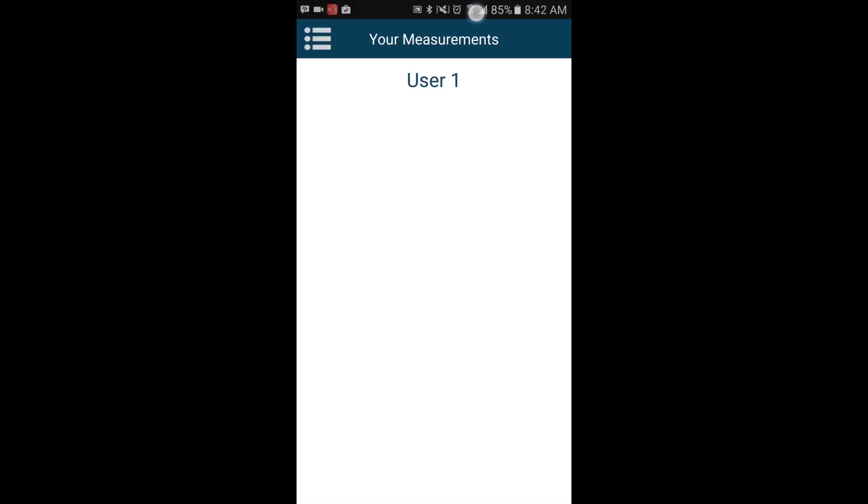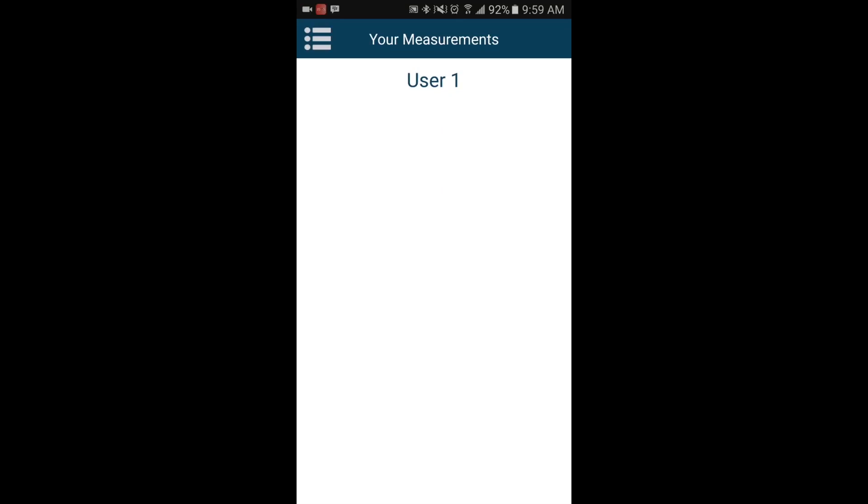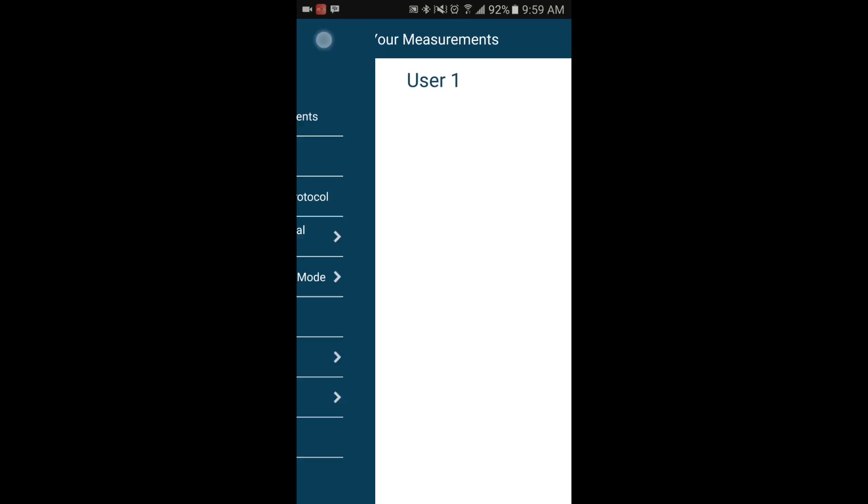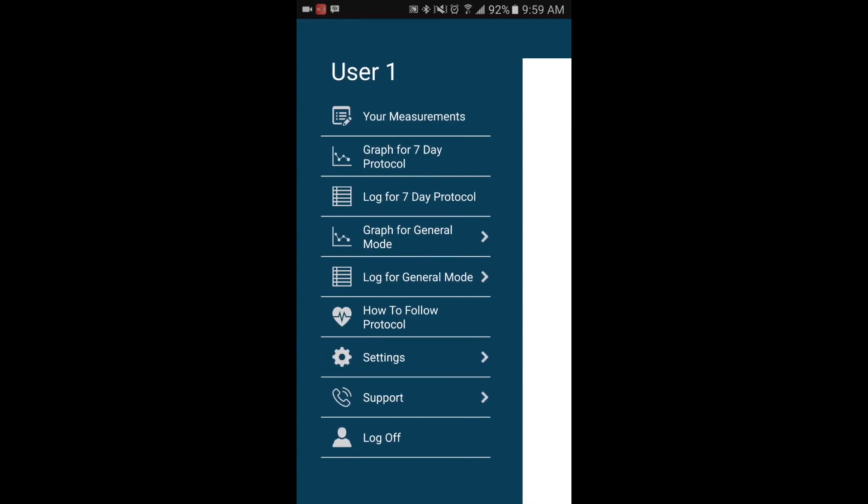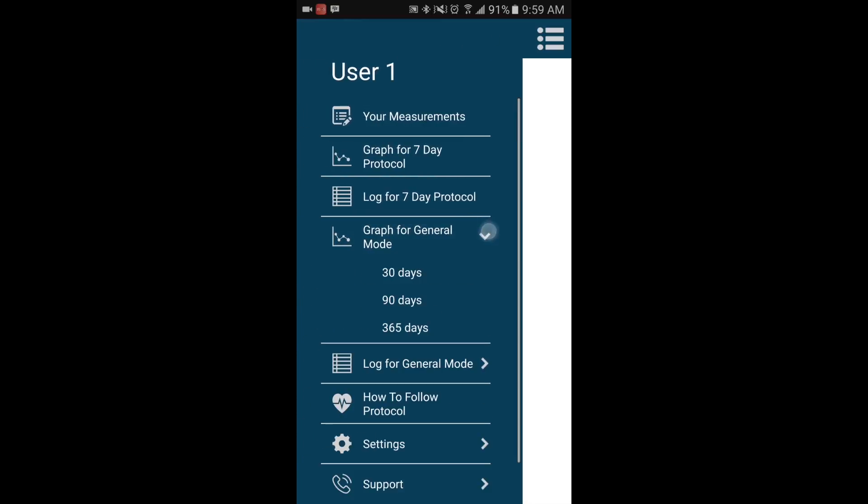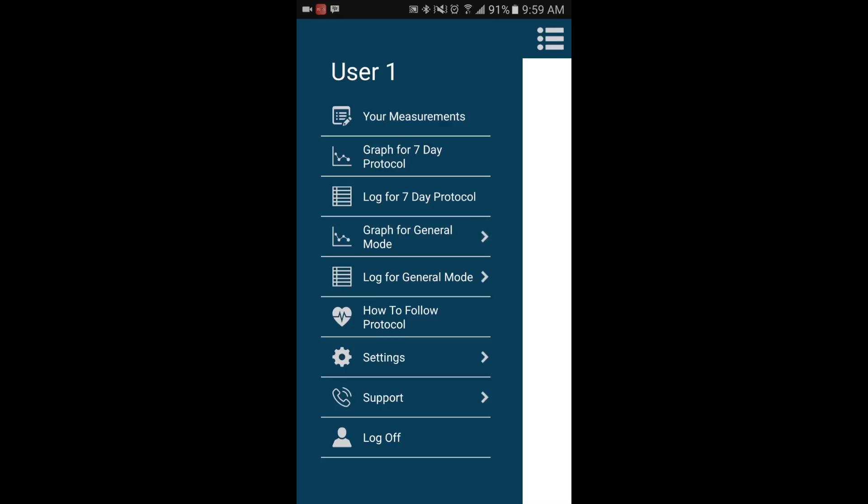Here you will see User 1 with no measurements showing. From the home screen, you can access the app's menu by selecting the icon in the top left corner.